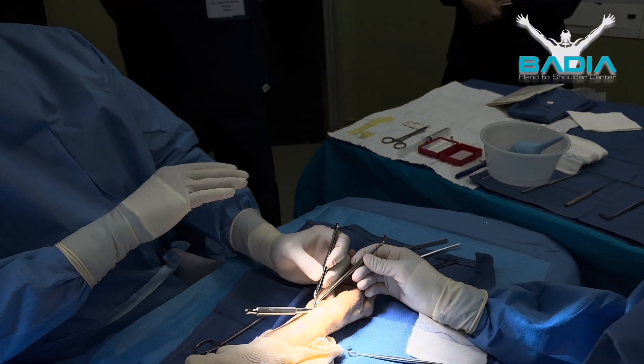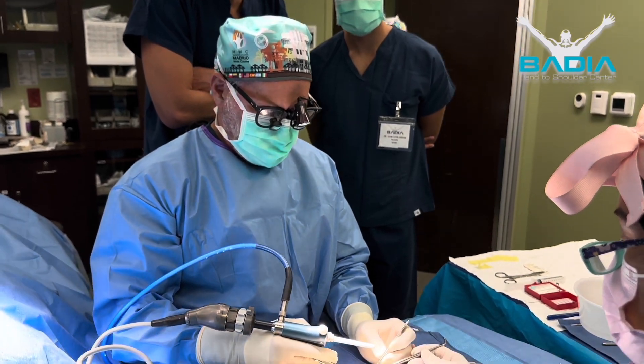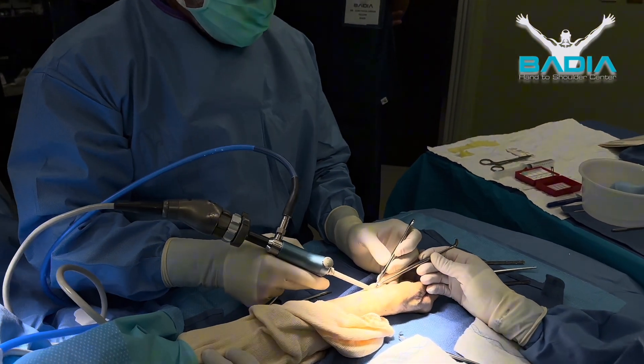You want to separate the flexor tendons and the median nerve away from the transverse carpal ligament. And then this — lights off.